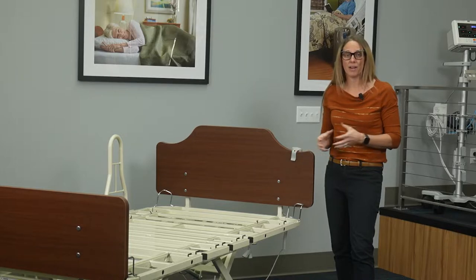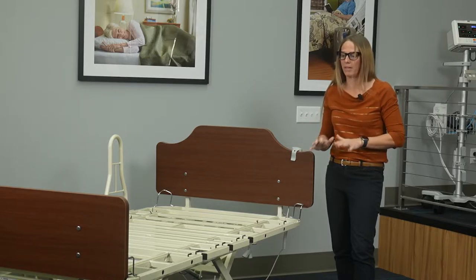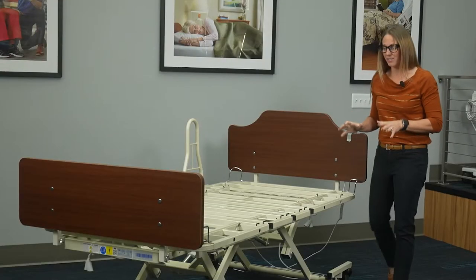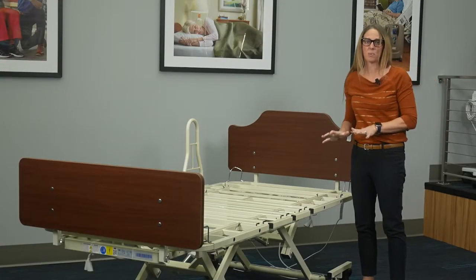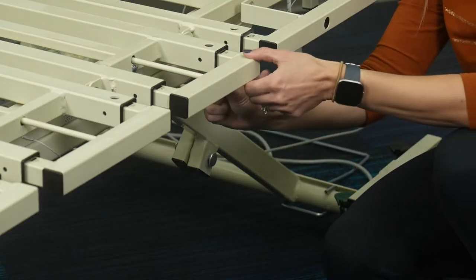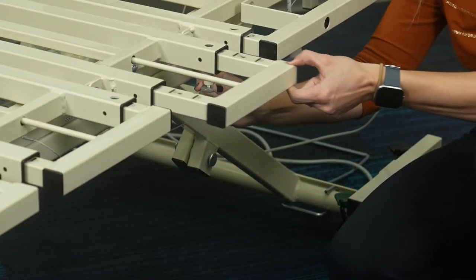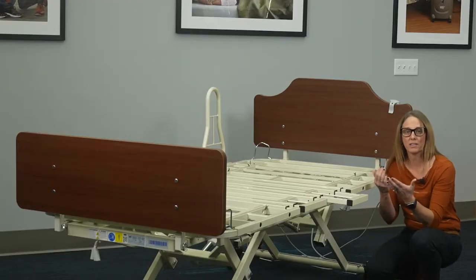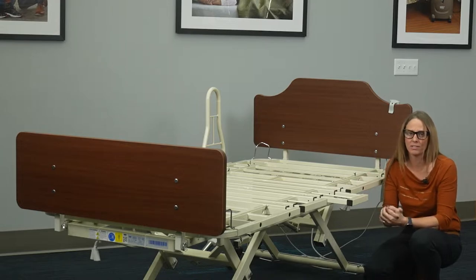The Panacea 8000 bariatric bed has a steel ribbed deck, making it extremely durable and easy to clean. Plus it's got built-in expandability in both width and length — toollessly, I can expand it from 39 to 42 to 48 inches wide, and I can expand the length at the foot section from 80 to 84 inches long.